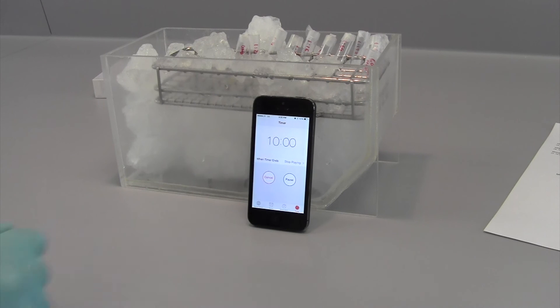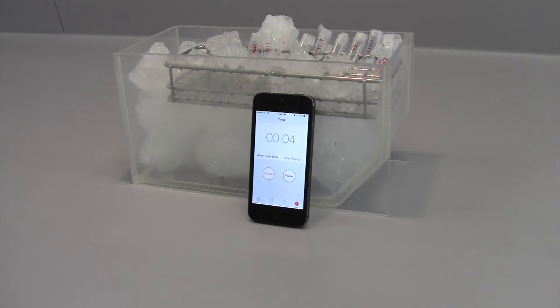After incubation, transfer the samples instantly into an ice bath. Remember to keep the samples on ice until tested, but the minimum duration of the ice bath is 10 minutes.